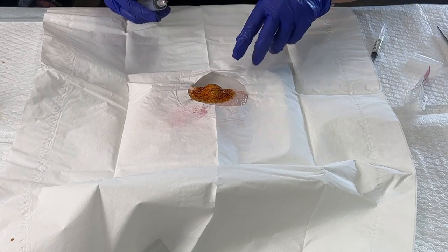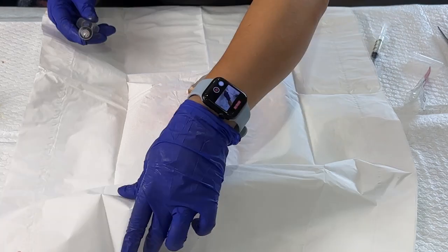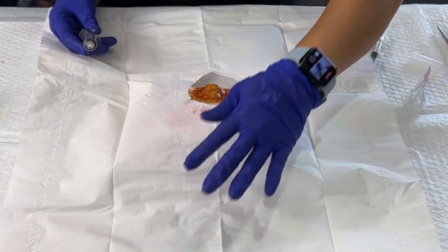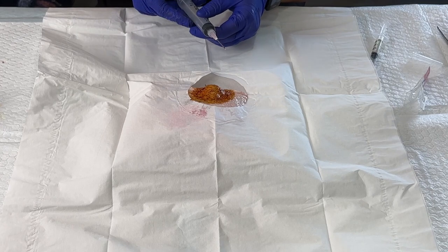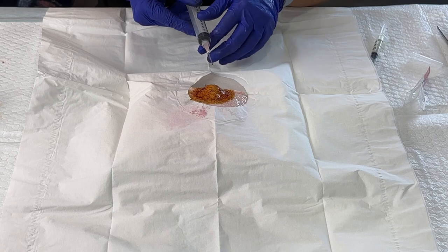Then I'm ready to go. The patient is nice and numb and I'm ready to go ahead and proceed. I'm going to go bevel up and I'm going to make sure there's no air in my syringe.